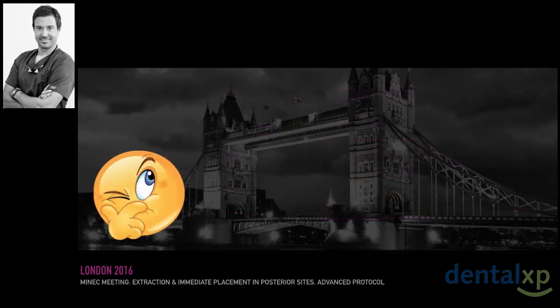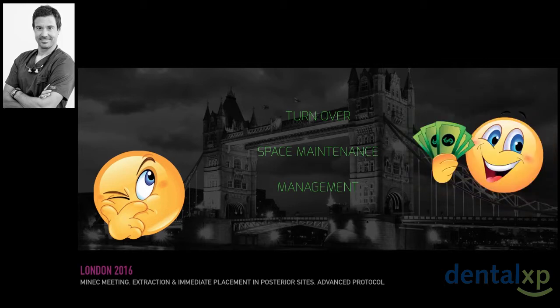So, what do I use to preserve the bone? I need a biomaterial that covers all my expectations in terms of turnover. I need a bone graft that has a quick transformation into vital bone. Space maintenance in the long term, or preservation of the original volume. Management: a graft with good handling and stability once it's placed. And of course, not too expensive.